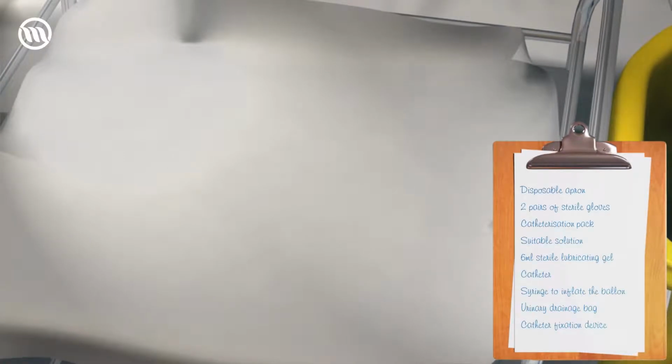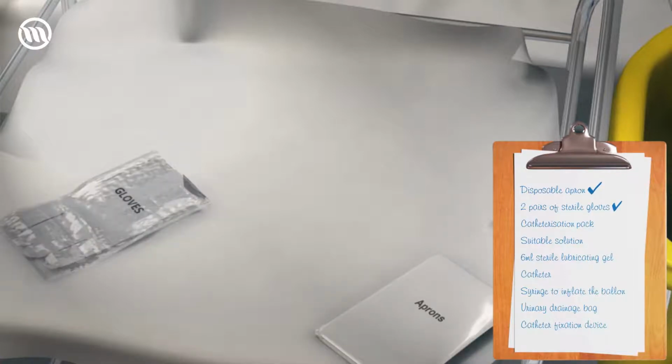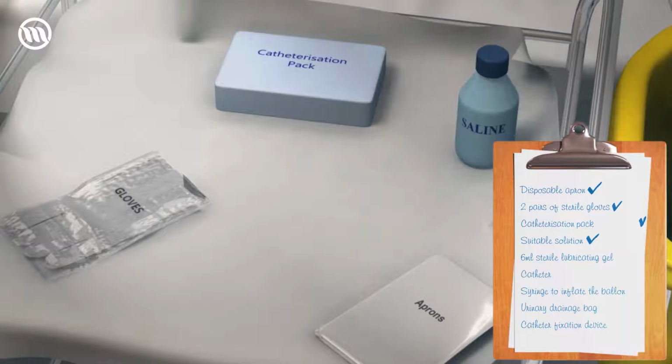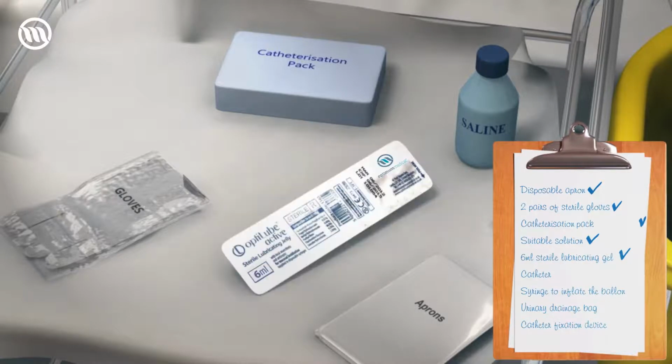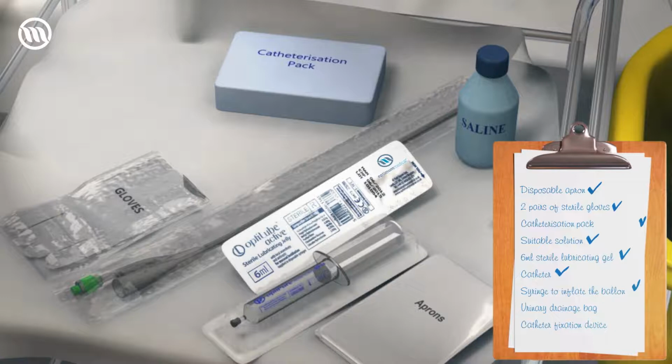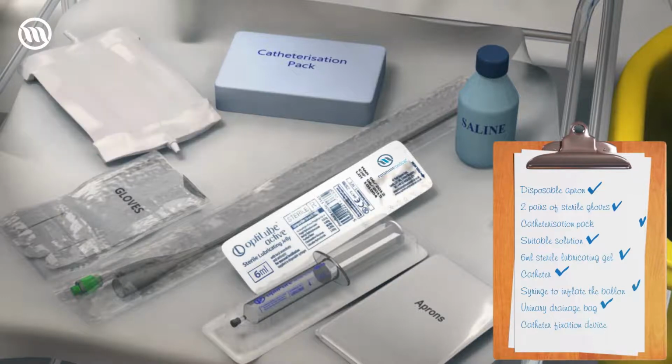Gather the equipment required. This should include a disposable apron, 2 pairs of sterile gloves. This may vary depending on whether your trust follows the Marsden Manual or ANTT. A catheterization pack, a suitable solution to clean the genital area. Check your local policy to make sure you are using an approved solution. Sterile lubricating gel, the correct catheter, if applicable, a syringe to remove the existing catheter. A syringe with a suitable solution to inflate the balloon, a urinary drainage bag and a suitable catheter fixation device.